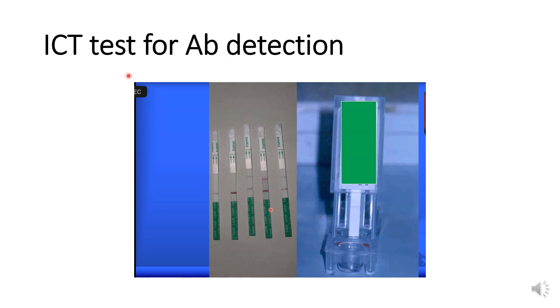This is the immunochromatography test for antibody detection against the antigen of Leishmania. And we can see this test is positive. Control band will also be there and test result will also show the band. And if there is only control band, the test will be negative. This is how immunochromatography test for diagnosis of Kala-Azar is done.